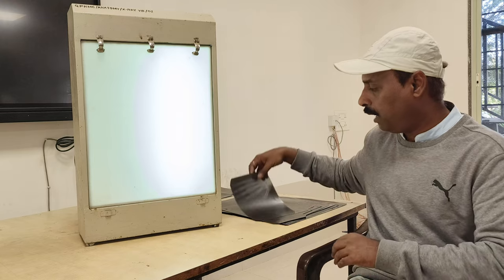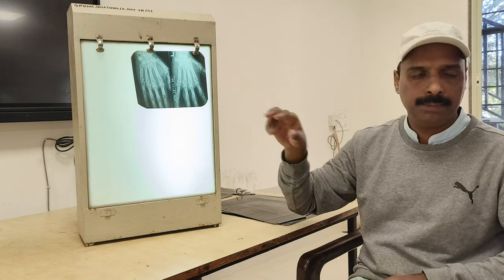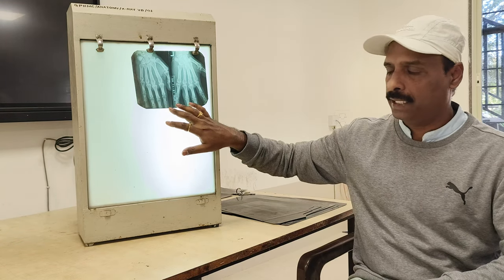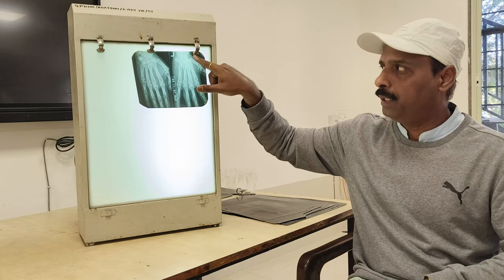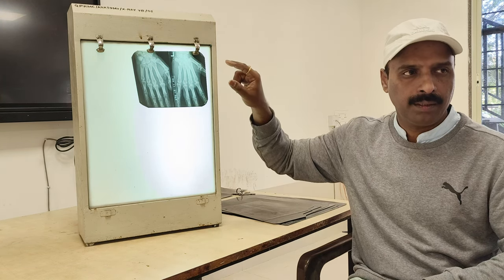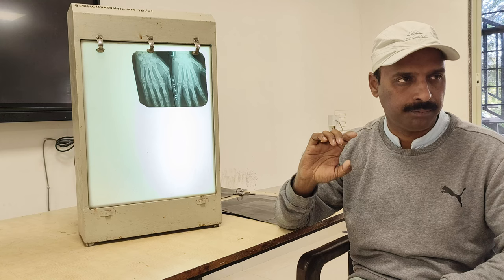Then next, we are already discussing the plain variety of x-ray. In this plain x-ray, we get the hand. We are going to get the hand x-rays. You can identify all the bones. Here we have the bones: the lower end of the radius and ulna. This is a plain x-ray of the hand, not the wrist joint, you have to tell.